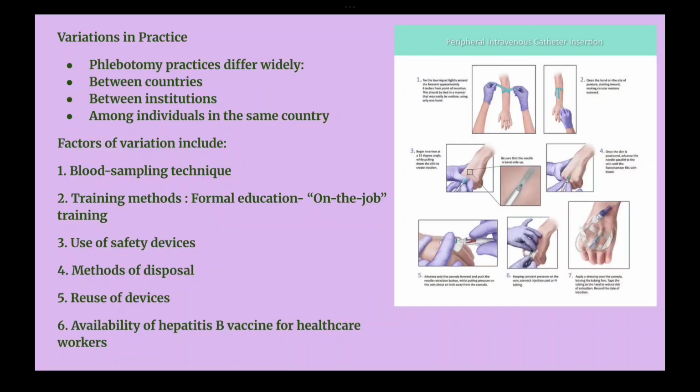Now the variation in practice of phlebotomy: phlebotomy practices differ widely between countries, between institutions, and among individuals in the same country. So it might be different in the USA and it might be different in India. It might differ in different hospital institutions, or it might differ depending on the person who is conducting the blood drawing.